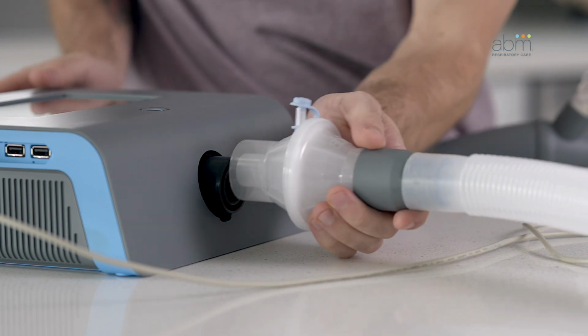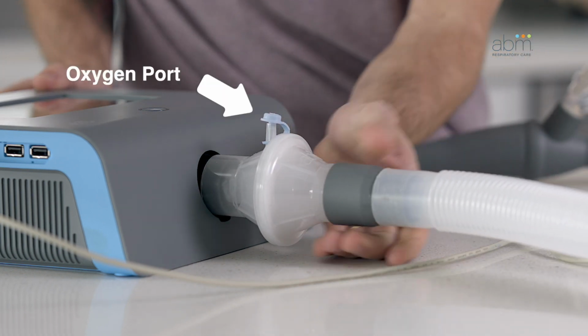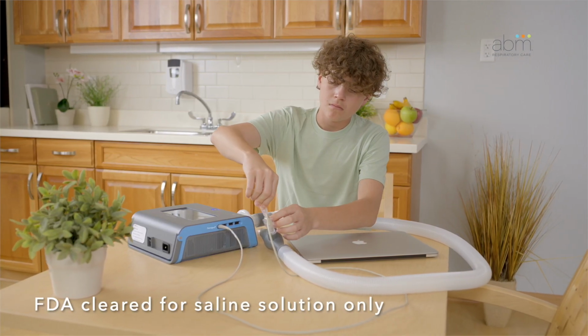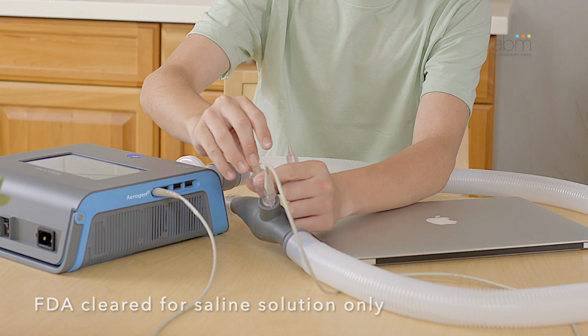Attach the end of the bacterial viral filter that has the oxygen port to the patient port of the control unit. Add the prescribed medication or saline to the nebulizer and insert the plug.